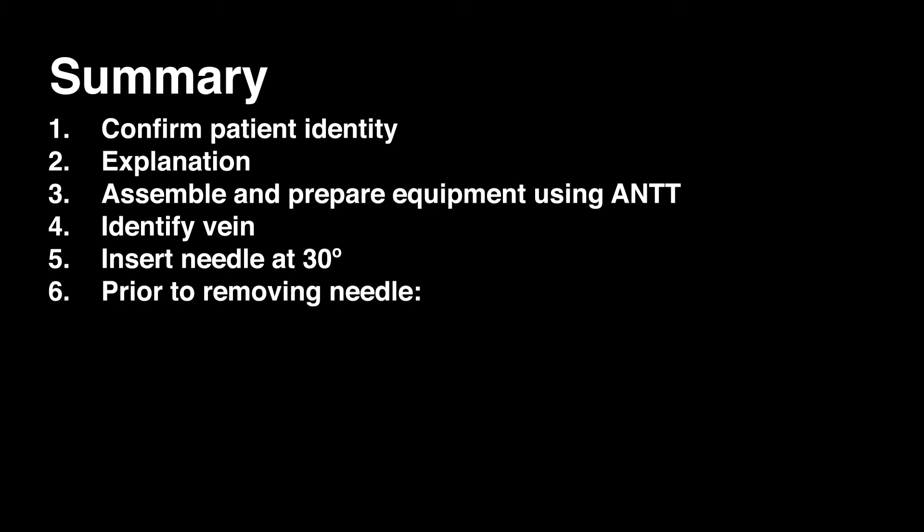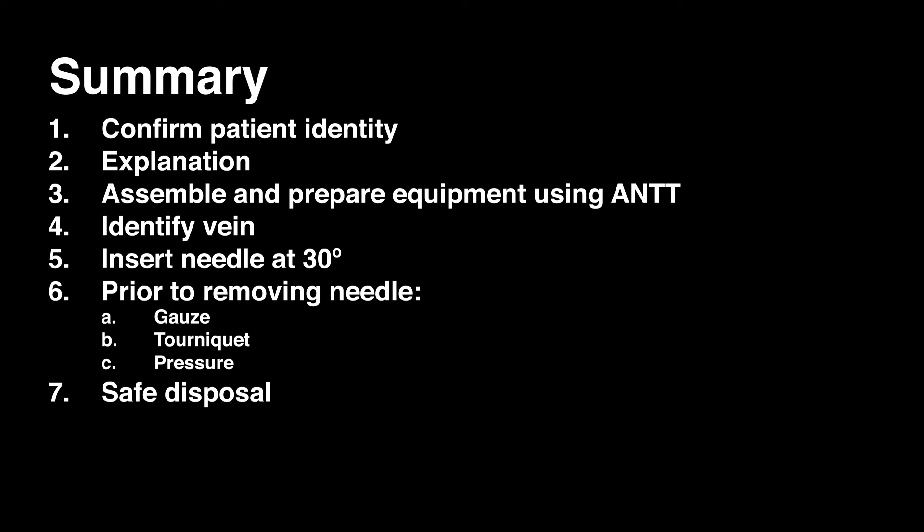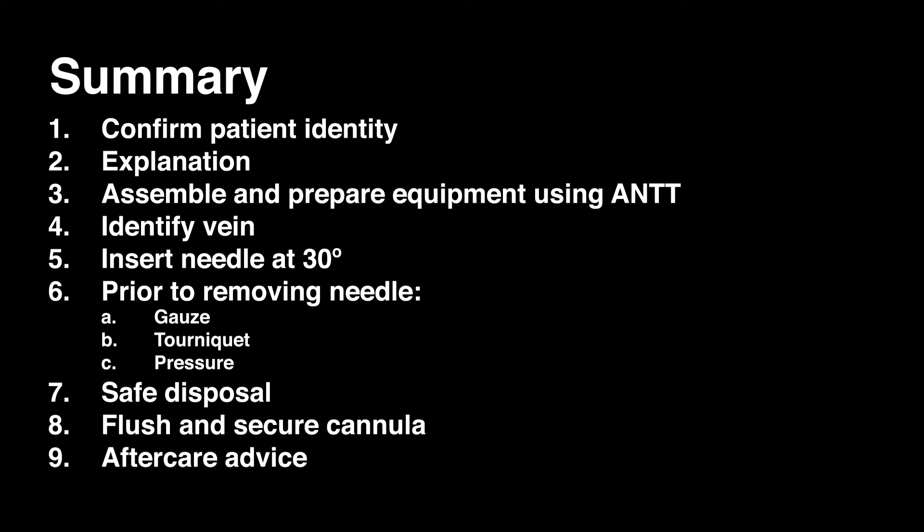In summary: ensure that you have prepared the patient and confirmed their identity. Assemble and prepare all equipment, ensuring an aseptic non-touch technique. Identify the appropriate vein. Insert the needle at approximately 30 degrees. Withdraw the needle slightly to observe for flashback and then advance your cannula. Once the cannula is fully in, prior to removing the needle, ensure that you have put gauze in place. Remove the tourniquet and apply pressure to the vein. The needle can then be safely removed. Dispose of all sharps safely. Attach any extension set and flush the cannula. Ensure the cannula is secured. Provide any aftercare advice to the patient and ensure that the correct documentation is filled out.